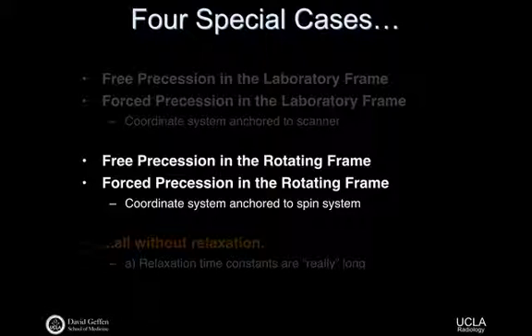Okay. So that's only part of our job, right? So at this point, we've done this one. We define the B1 in the rotating frame. And so let's keep it over here. So we said that our B1 field in the rotating frame as a function of time is just our B1 envelope function as a function of time on the i hat prime direction. Okay? Okay, so I'm going to clear this so we can get to the next step. Cool?